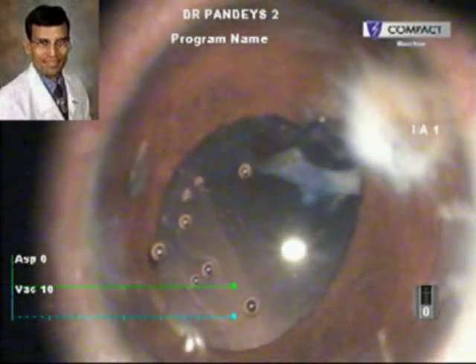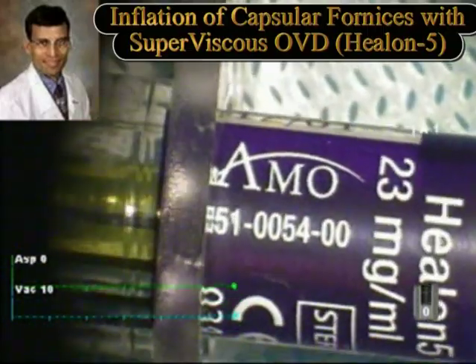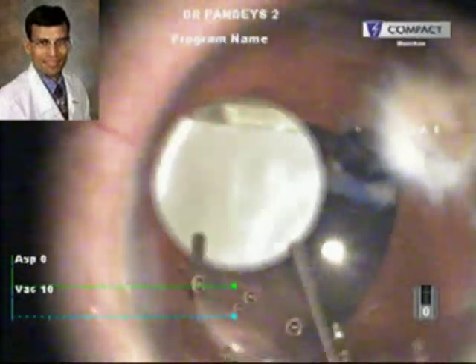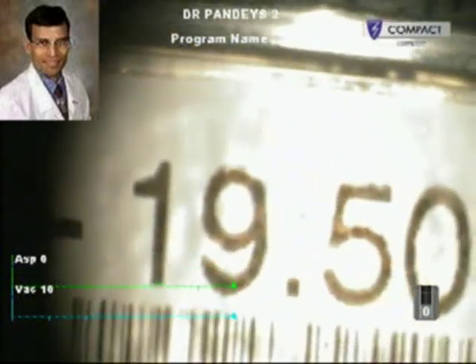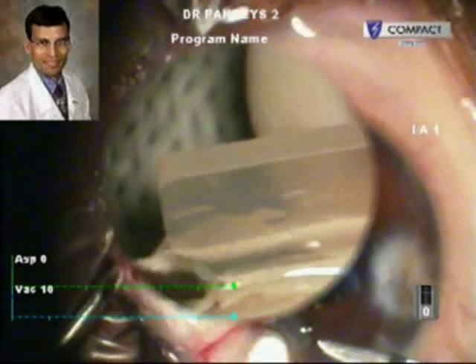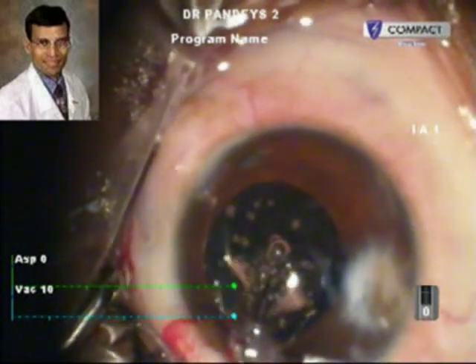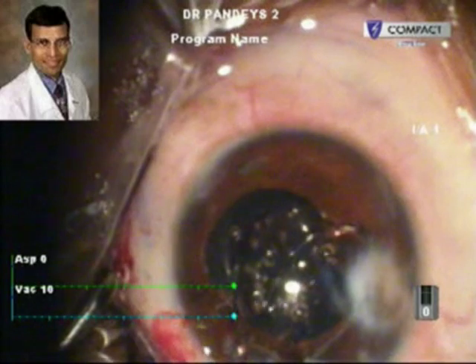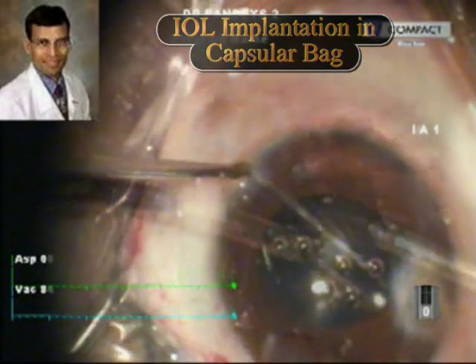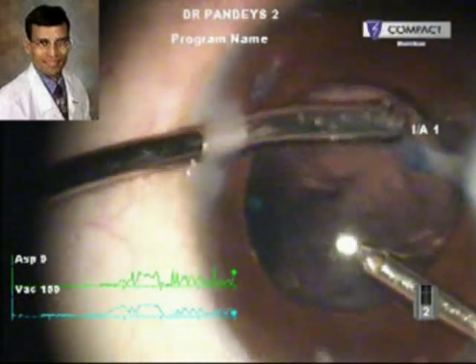Because the capsular bag was directly compromised due to the large piece of plaque that was removed, Healon 5 was used to inflate the capsular fornices to aid in IOL implantation. This is a single-piece hydrophilic acrylic IOL which is being implanted. A 3-piece IOL should always be avoided in these cases because it can be traumatic. The implantation is more difficult and haptic management may also become difficult in the presence of a posterior capsule tear or posterior capsular rhexis as in this case. Once the IOL was carefully placed, the viscoelastic is being removed from the anterior chamber as well as from under the IOL.